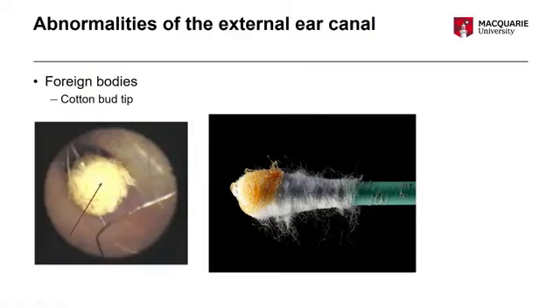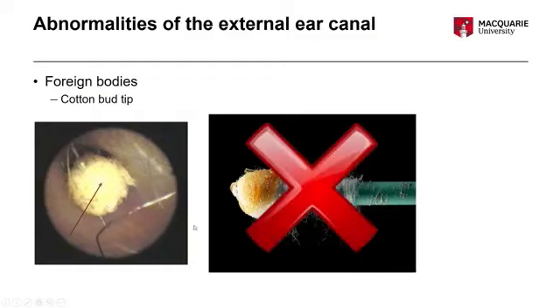Okay, so this is a tip of a cotton bud that's fallen off the cotton bud and stayed in the client's ear. That's not a particularly uncommon thing to see. So we don't use cotton buds. We don't recommend clients use cotton buds. We actually discourage them from doing that.